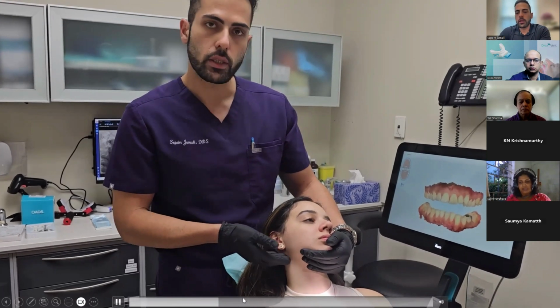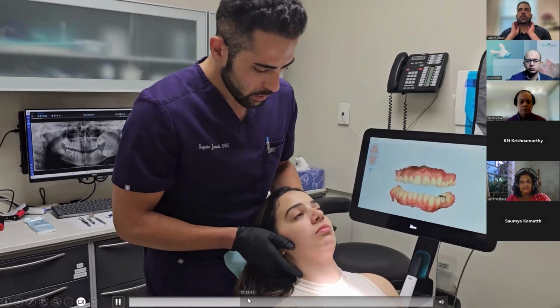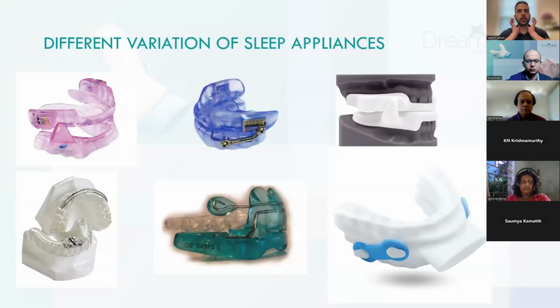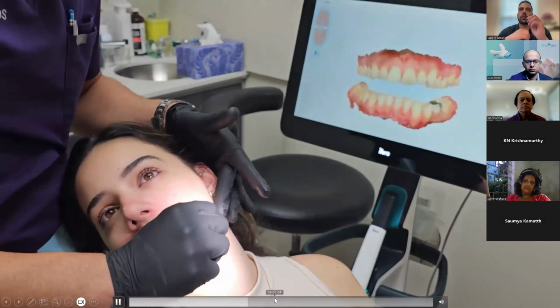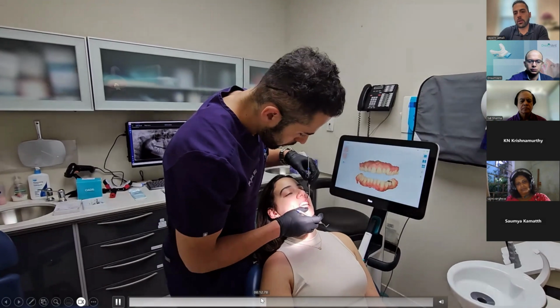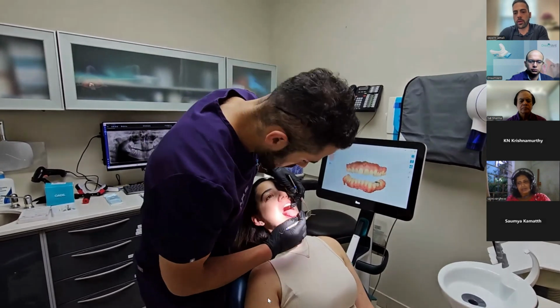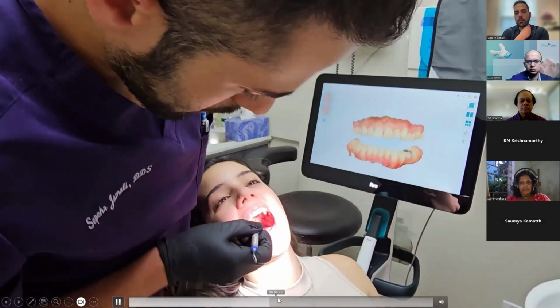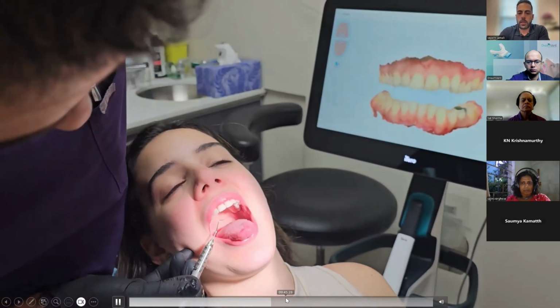And then another important muscle to check besides the masseter and temporalis is also the sternocleidomastoid. Again, even as you protrude your jaw forward, that's one of the muscles that gets some strain on it. So make sure that you have the baseline on that. A lot of times patients don't notice this stuff until after they start using the appliance and you tell them to check the muscle. So we have to have a very good baseline record. So later on, if the patient is developing any type of additional strain or problem relating to their muscles or neck stiffness, or anything that is not being resolved a few hours after waking up, then we know that we are going above the normal range that the patient can get accustomed to.